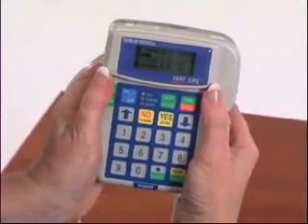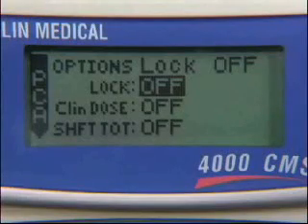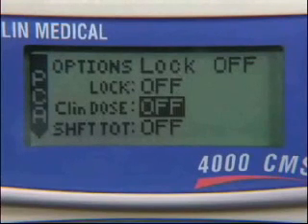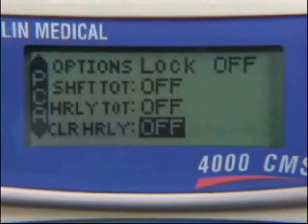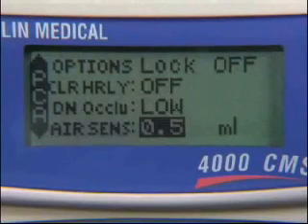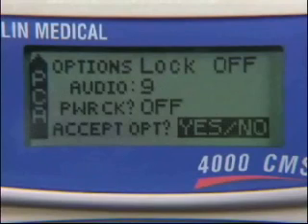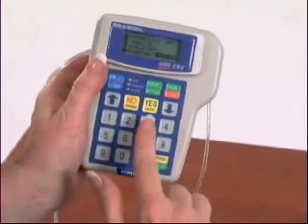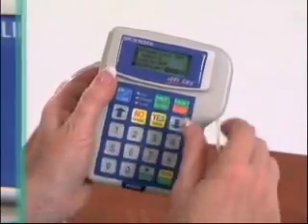To view the features on the Options menu, select Help Options. The following features will be shown as the down arrow is pressed: lock level, clinician dose, shift totals, hourly totals, clear hourly totals, downstream occlusion setting, air sensitivity setting, audio alarm level, and power check. At the end of scrolling, you will be at the Accept Options prompt. Select Yes Enter to accept changes, or the No Change button to leave without making any changes.